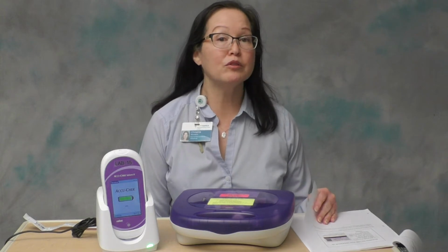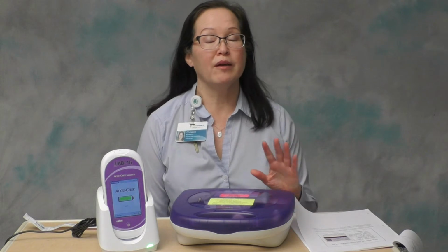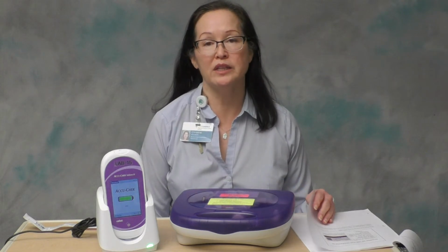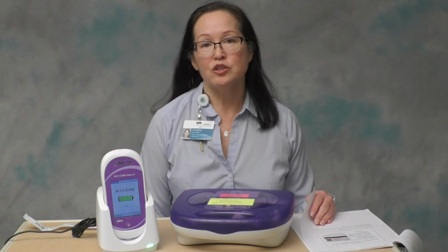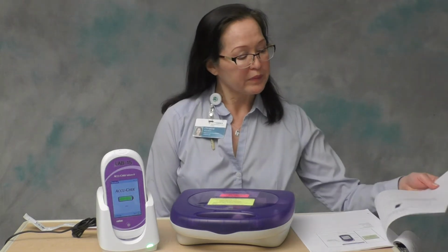If you are a traveler or a student, you may only have a 5-digit number that's preceded with a letter T. You'll not be able to scan that badge. You'll have to manually enter your user ID number, and you replace the T with a 0.